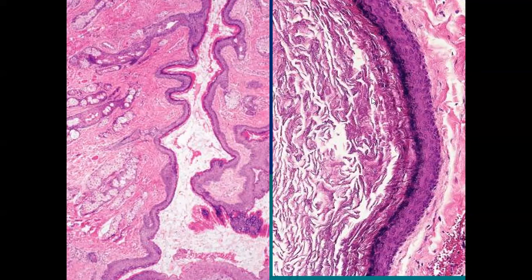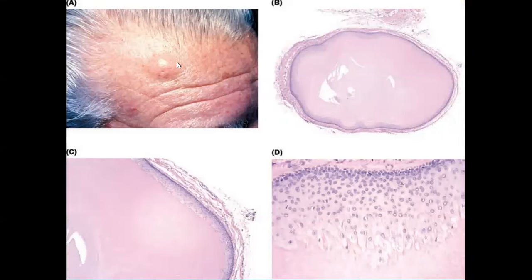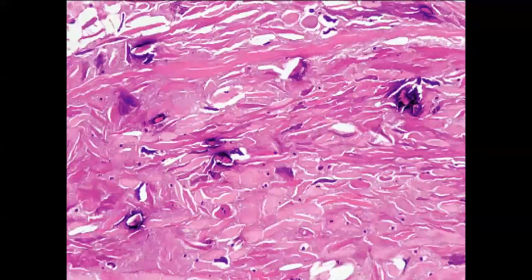A sebaceous cyst or steatocystoma multiplex is a soft cyst with multiple sebaceous glands in its wall. A pilar cyst shows pilar (homogeneous) keratinization and lacks a granular layer — this can be seen in a cystic lesion on the forehead. Calcinosis cutis shows bluish irregular calcium deposits within the collagen.